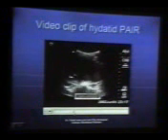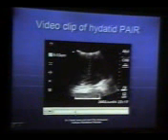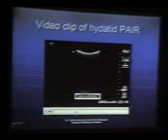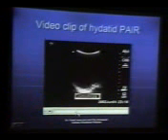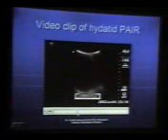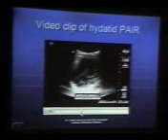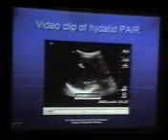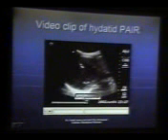I'm looking for the spot to go in. Soon you will see the needle. The safest route is chosen where we don't want to go into any important structures or liver vessels, etc. This is the needle, the shining line within the cyst.